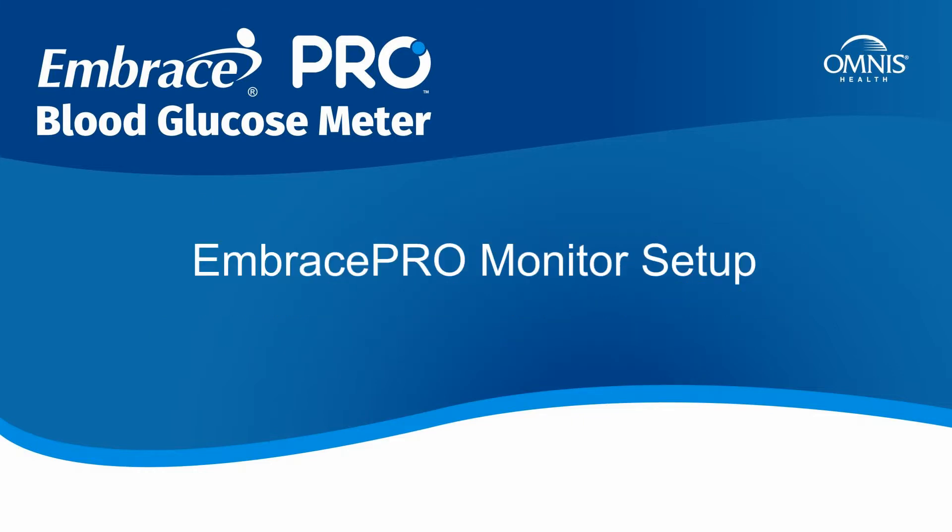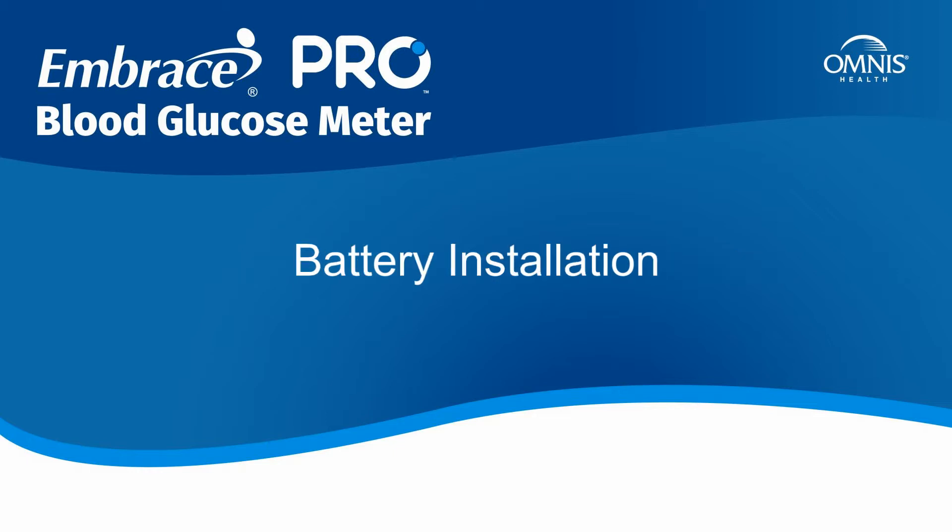EmbracePro Monitor Setup. Battery Installation.